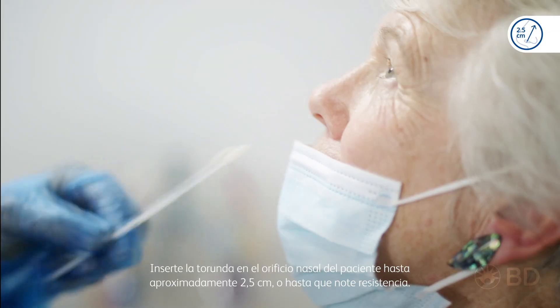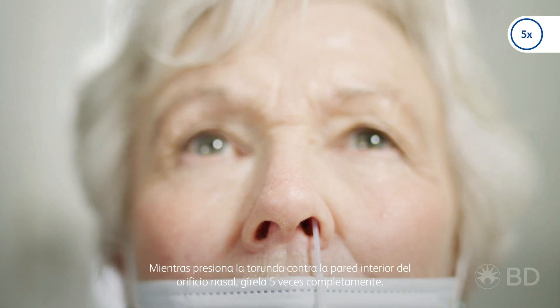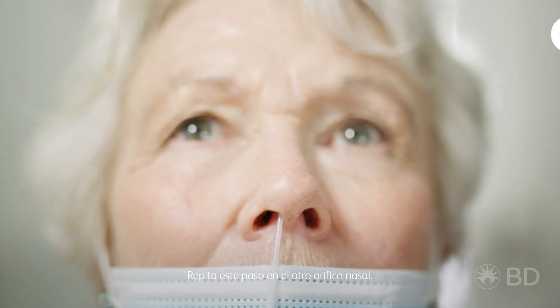Insert the swab into your patient's nostril, around 2.5 centimetres or until you feel resistance. While pressing the swab against the inside of the nostril, turn it for five full rotations, then repeat the step on the other nostril.